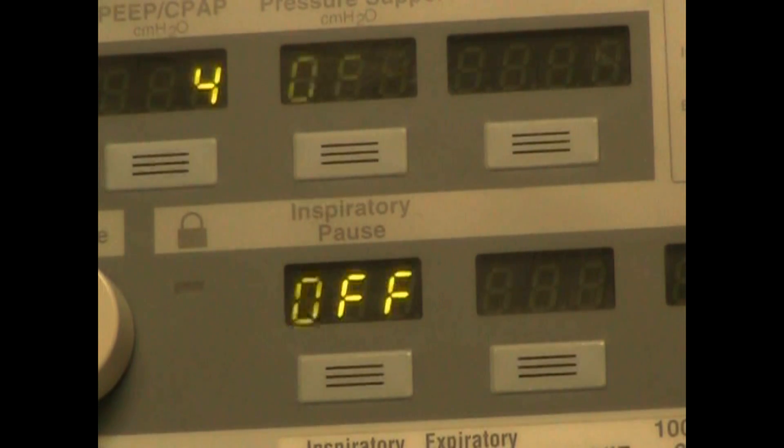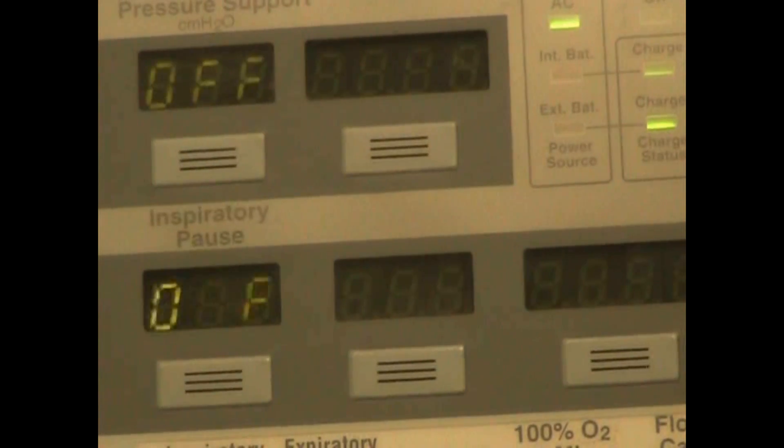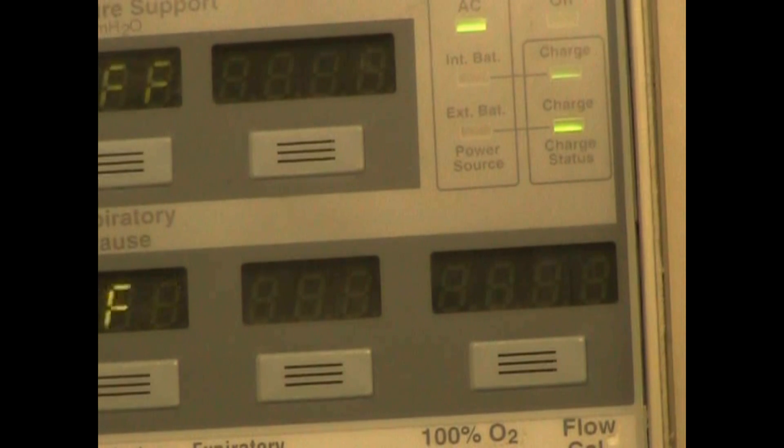Moving along the bottom of the second row we have the inspiratory pause, and also on some ventilators you will see expiratory pause, and then a last button for additional functions.